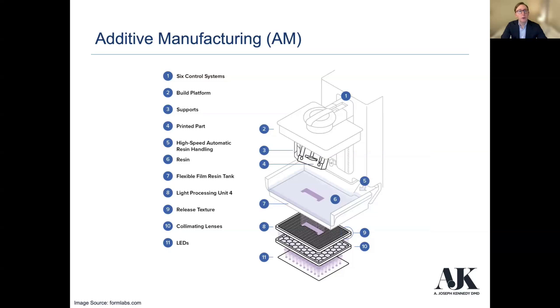Now, conversely, we also have additive manufacturing, and this is what we're going to touch base on tonight. So this is a great diagram. This is the Formlabs printer, but many of them are similar in their mechanism. I just used this because I thought they had a really good diagram to explain this.